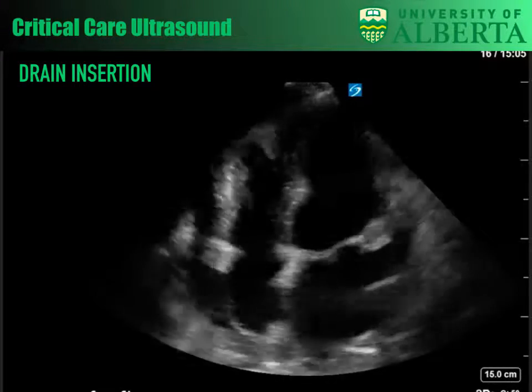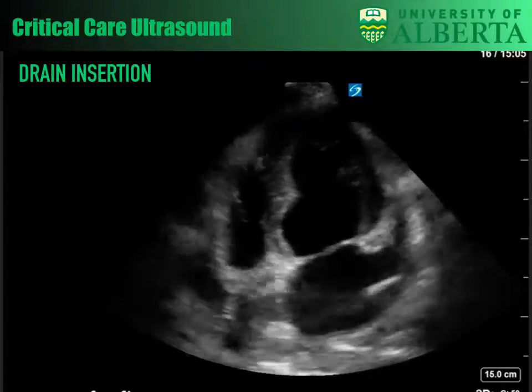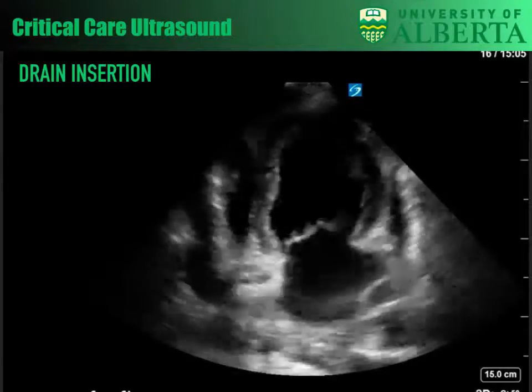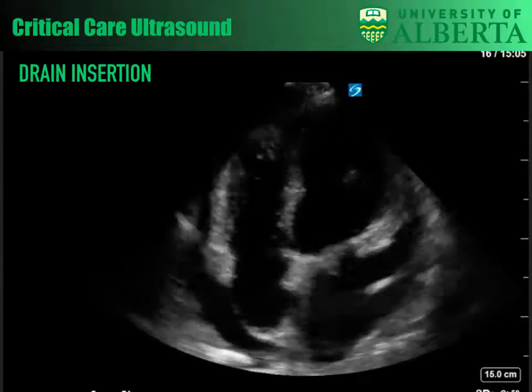Now, there's a drain insertion here, and just sweeping through, you can see it right there. So it hasn't had a lot of drainage. There's still some pericardial fluid there, but you can see there's less collapse of the right atrium and the right ventricle. But this patient did clinically improve even with the drainage of a small amount of pericardial fluid.